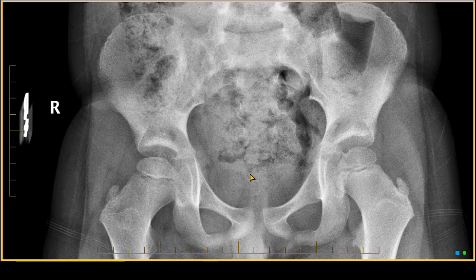What immediately grabs my attention is the density on one side versus the other. You notice this side is quite a bit brighter than on the contralateral side. In addition, there is a linear thin lucency just under the chondral surface on the right, as you see here. On the left there's no similar lucency.